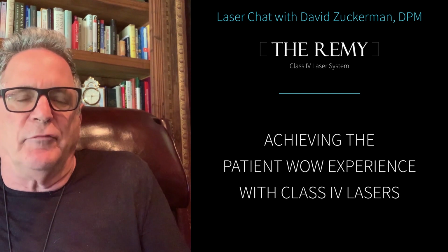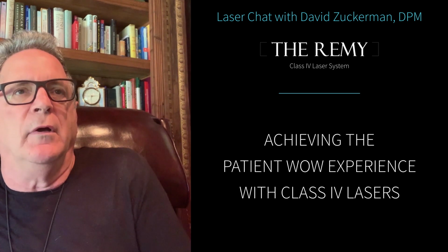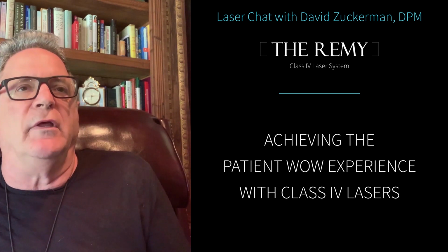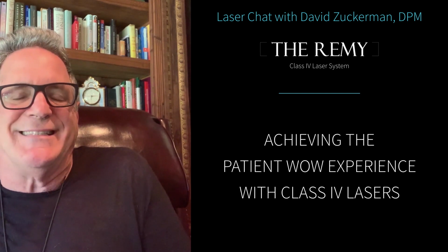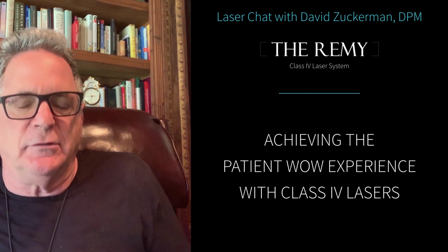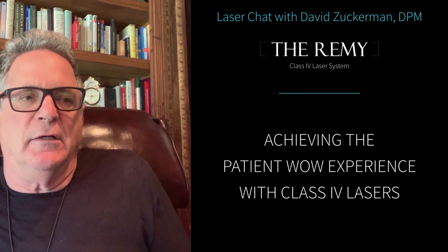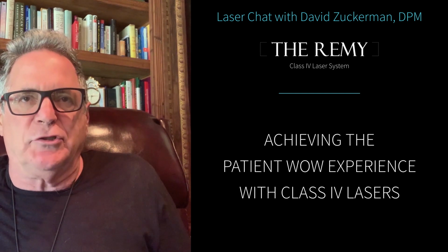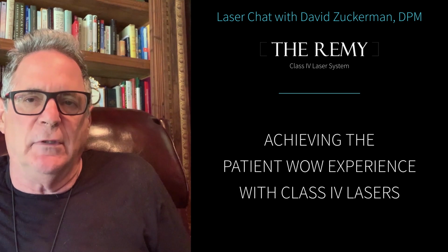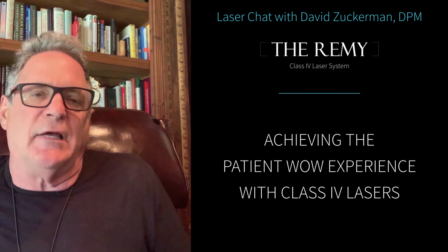This time, after I treated him, he felt really good. The first time he felt really good, but this time he got complete relief. Now, it could have been the fact that it was the second treatment. Accumulation of laser therapy and photobiostimulation can accelerate the healing. However, my impression was that you need to do a biomechanical evaluation, a neurological evaluation. I did treat his posterior tibial tarsal area as well. There could be neuritis going on, plantar neuritis, capsulitis.